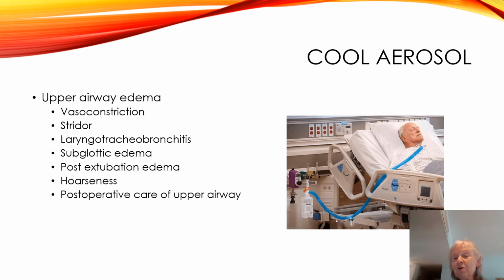So what do we have to do if we're going to do this? Remember when we talked about humidity, you have to have a thermometer, and the thermometer has to be proximal to the patient. And that's how we go ahead and watch the temperature at that point, because we don't want this patient getting burned by the aerosols we're delivering. We can also use it to increase the amount of humidity we're offering for these patients.